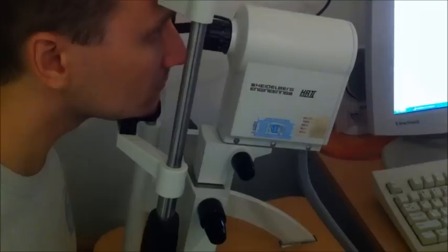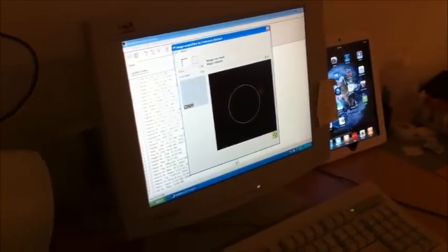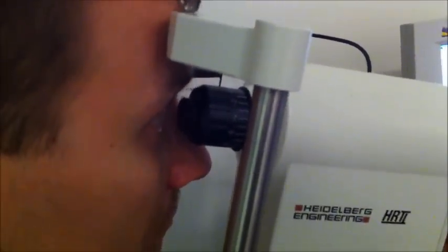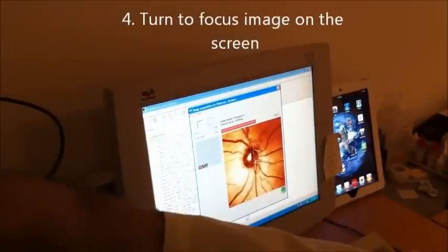Once you have everything roughly aligned, you go back to the main screen and click on the button here to start the laser — you'll hear a high-pitched noise. What you do is basically just align it and bring it forward until, when the patient blinks, their lashes just touch the lens. We're going to look at the screen over here and use this little lens here. Can you see a little green light off to the left of the red box? So I want you to look right at that for me.